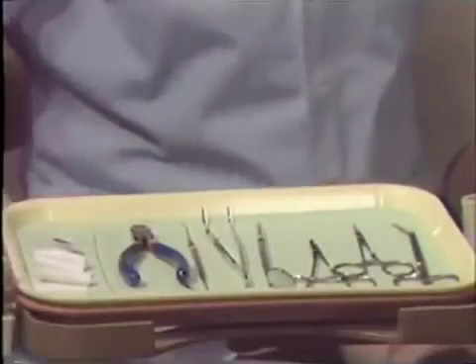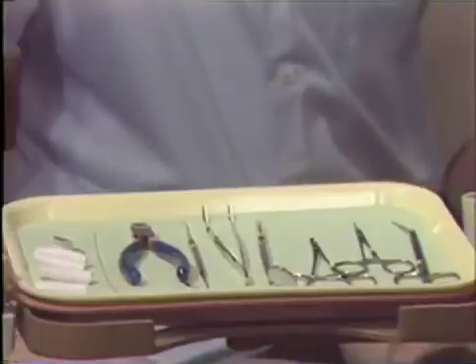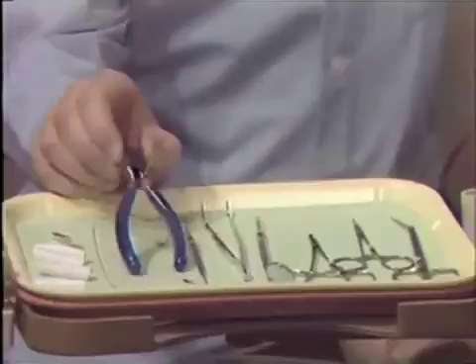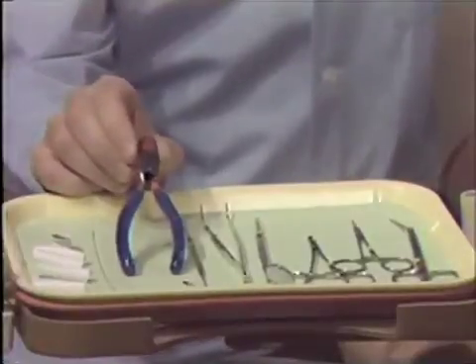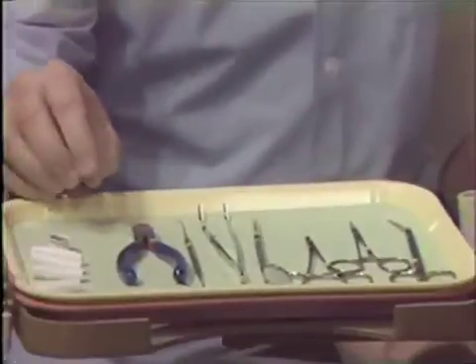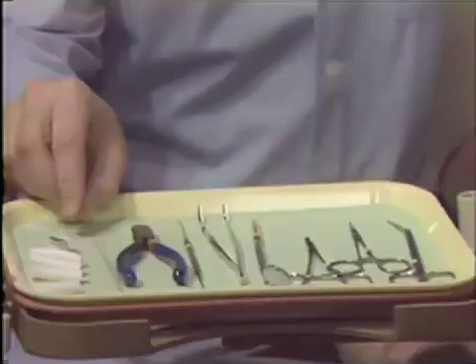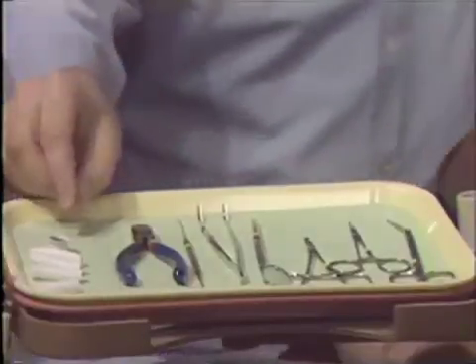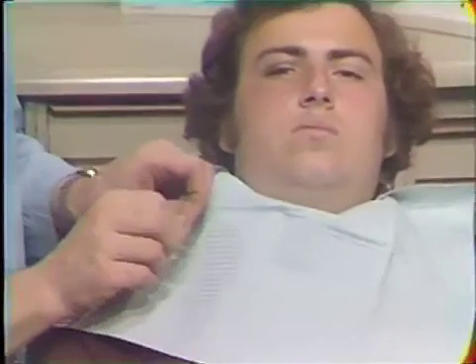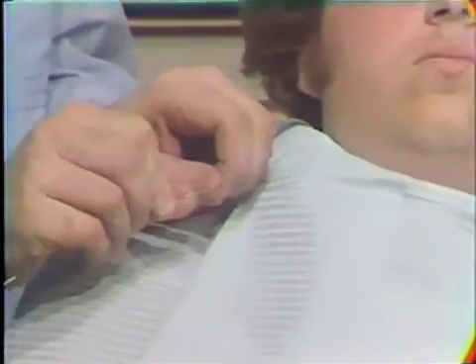Now let's go back to the tray setup. Rather than making this a difficult procedure requiring many instruments, the only important thing is to have a set of good pliers—Star makes some like this—and the wire. The wire is a number 22 by 28 rectangular orthodontic wire. We'll start the procedure by bending the wire; it doesn't take any special orthodontic tools. We just bend a nice curvature with the ends of our thumbs.